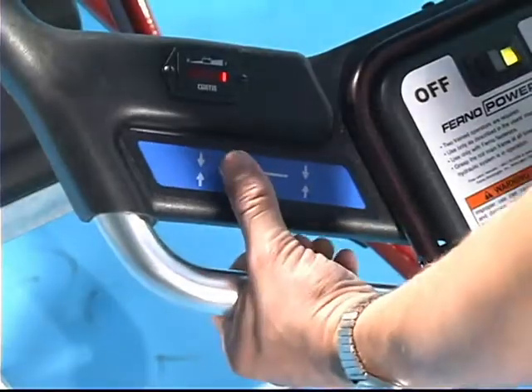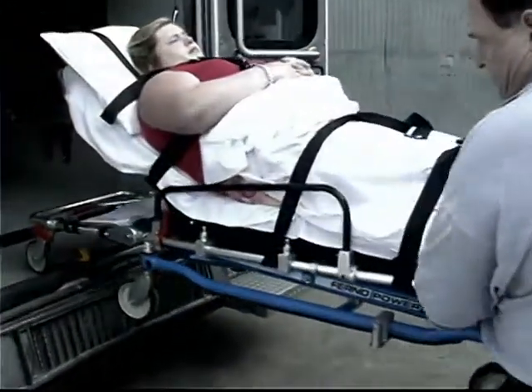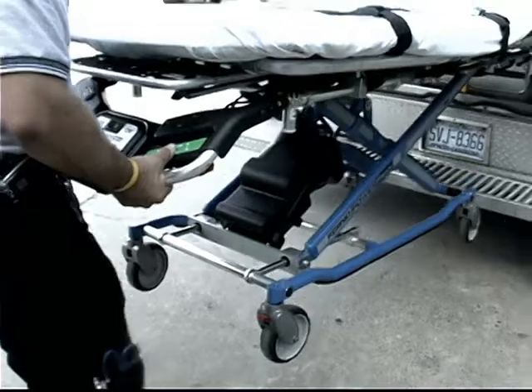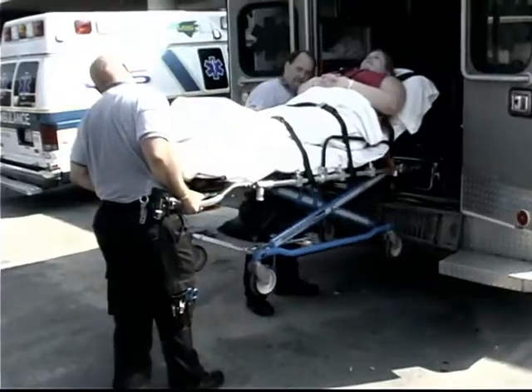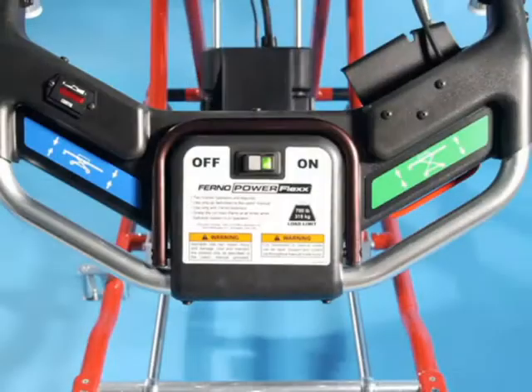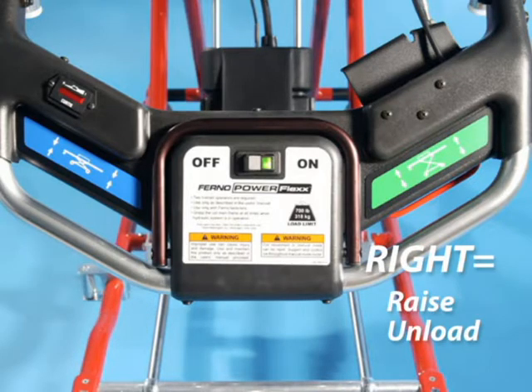Press any part of the blue touchpad on the operator's left to lower the cot, fold the cot, or load the cot into an ambulance. Press any part of the green touchpad on the operator's right to raise the cot or extend the legs when unloading the cot from an ambulance. Use the following memory aid to remember the touchpad functions: left equals lower or load; right equals raise or unload.